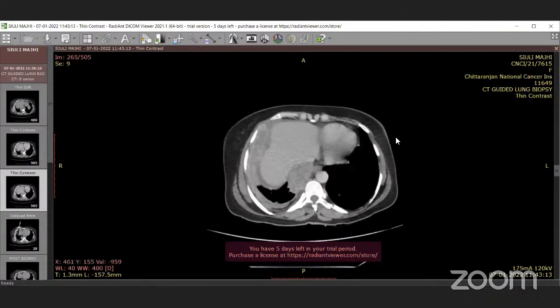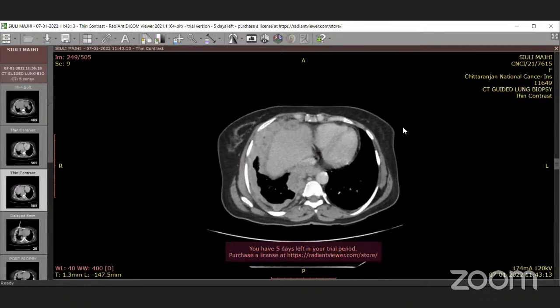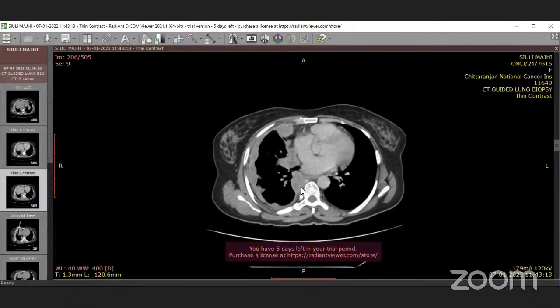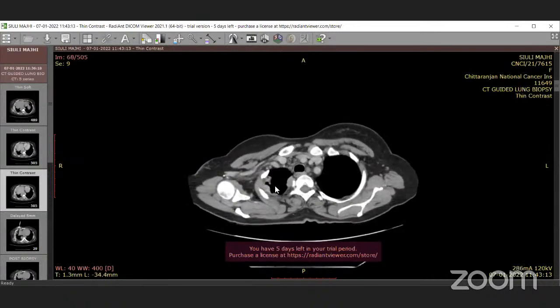Yeah. Okay, so this is a case of a pleural mesothelioma on the right. I think it is pretty obvious. The mediastinal pleura is thickened and nodular. So is the costal pleura. Okay, so we'll go to the part of the anatomy.